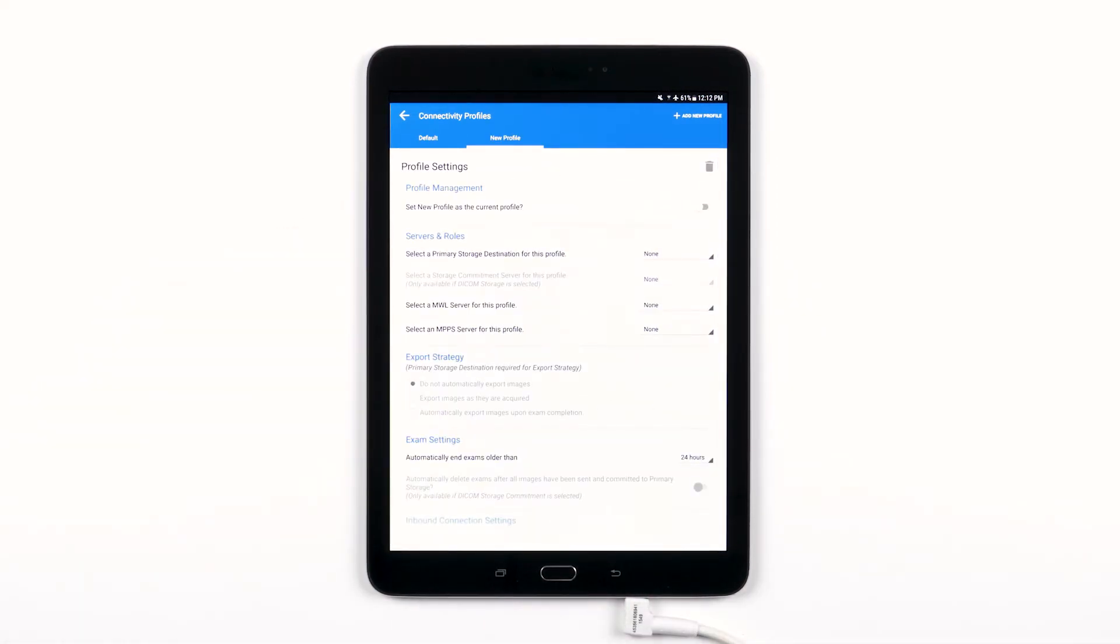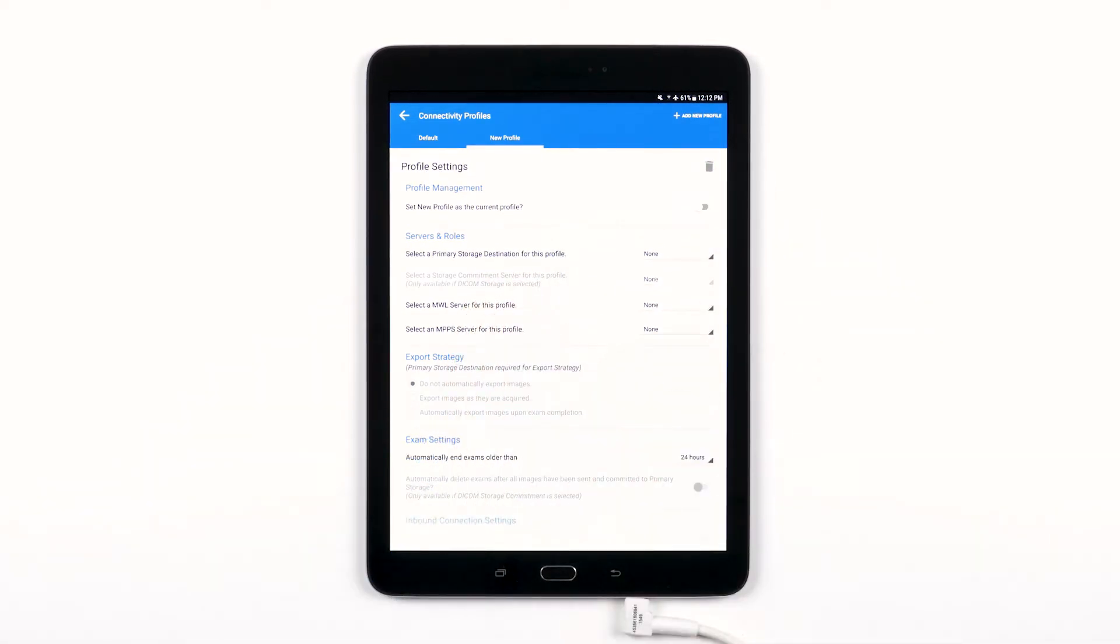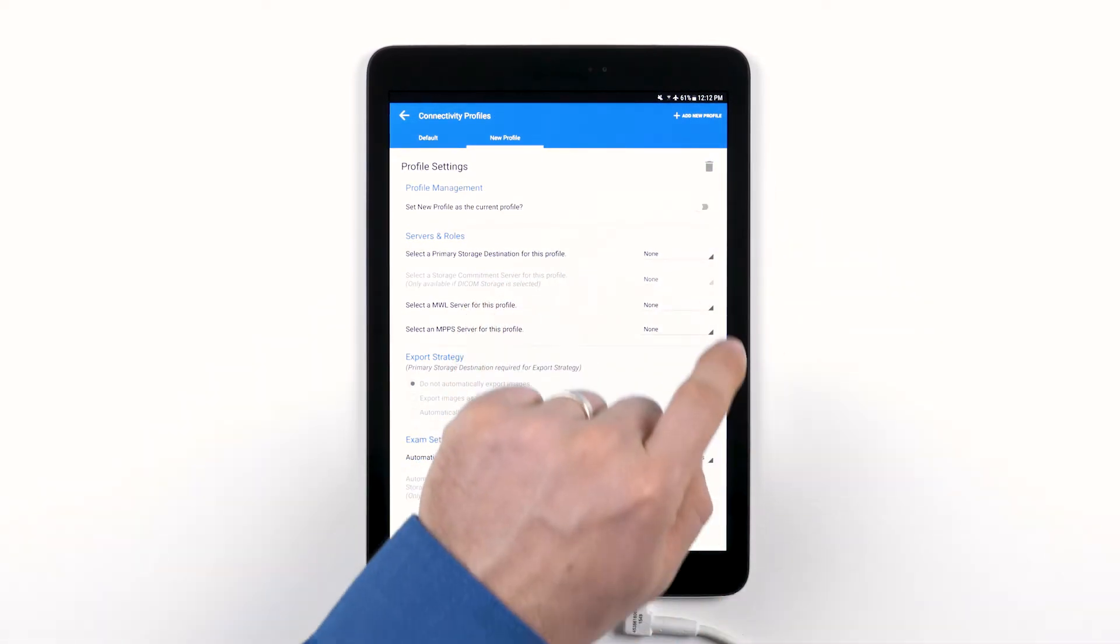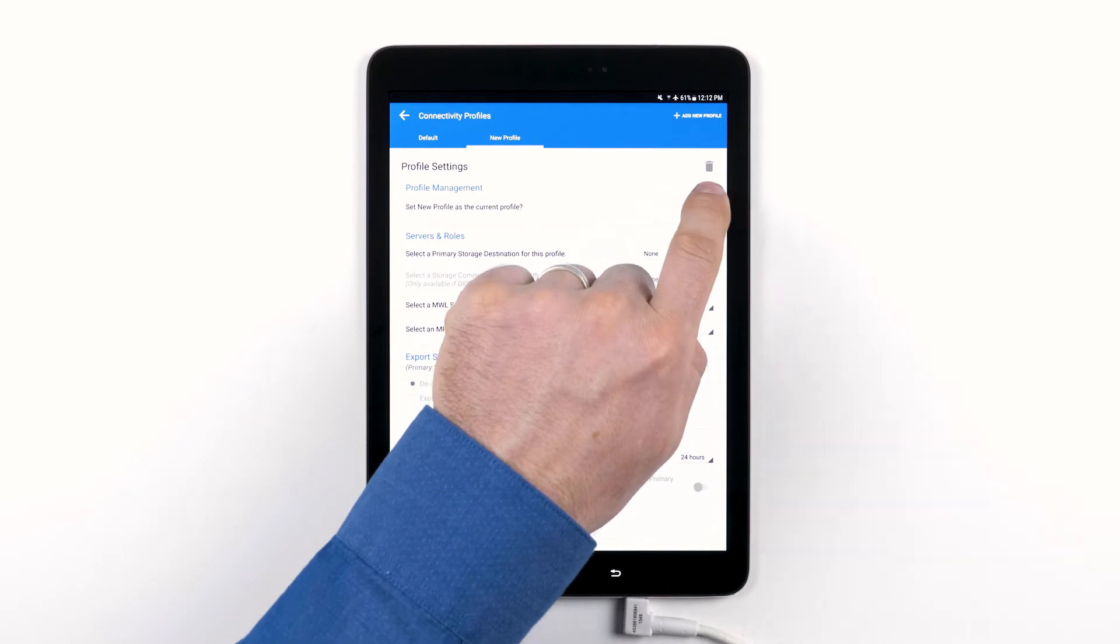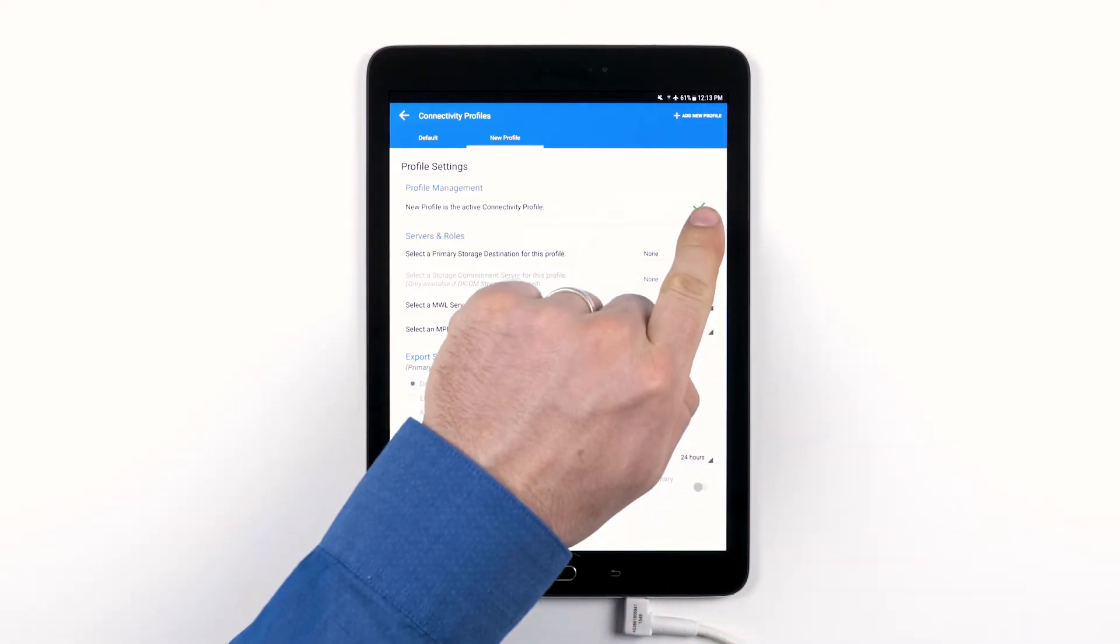Let's go over your options. You can delete a profile by tapping the trashcan icon. To activate and use this profile, tap the slider under Profile Management. Before switching connectivity profiles, you will need to first end an active exam. You'll know if the profile that you've chosen is active by the green checkmark.